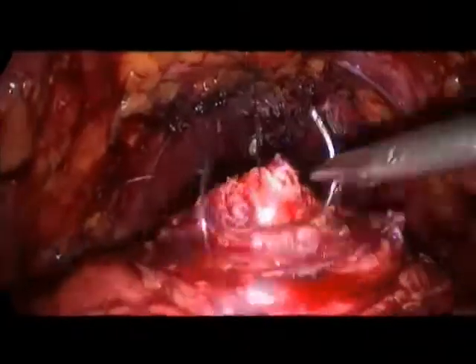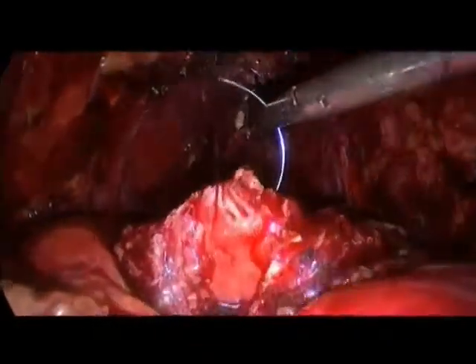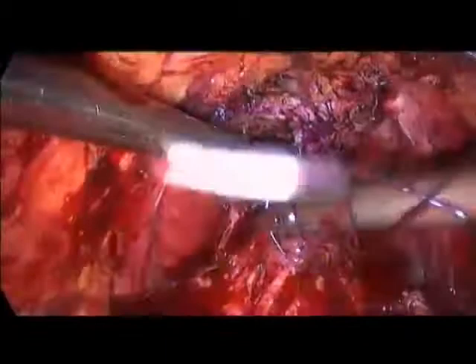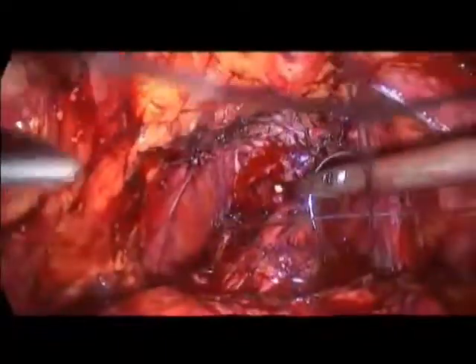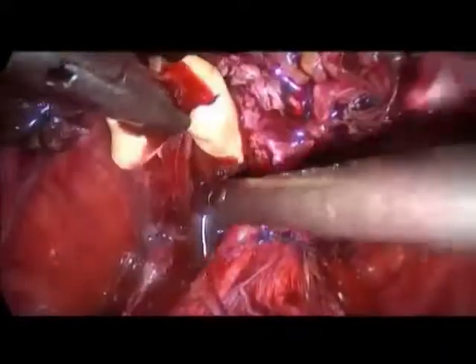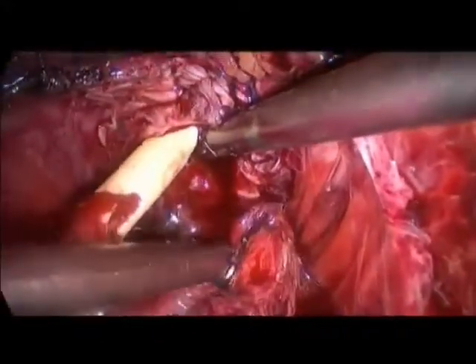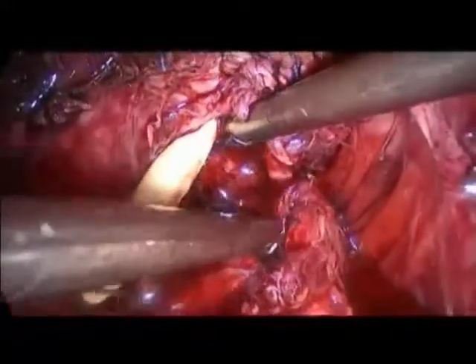Can you just expose it, yeah, like this. So we are... It's okay, the margin is good. Have you any margin of the bladder neck? Not of the bladder neck, no. The left upper margin. Not yet the bladder neck. Okay. If you need, I can do it from the moderating table. This looks definitely like a small median lobe. Okay, the next slide will be on the neck. Just a few minutes.